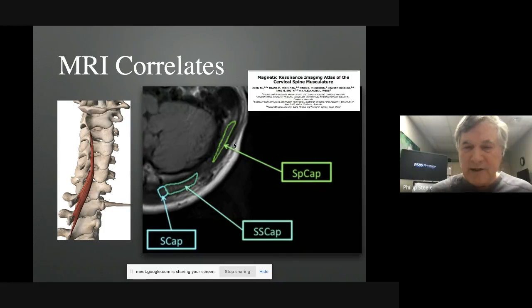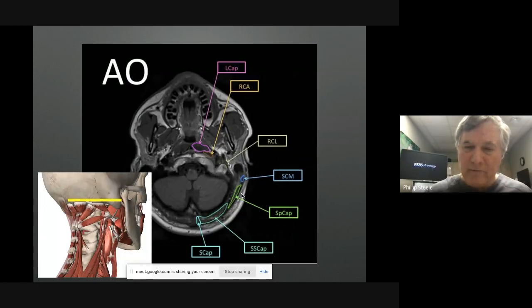That triangle area that I just showed you of the C1 was really difficult for me to figure out. And so then one day I'm scanning for any help. If you Google or use whatever search engine you want, MRI sliced image through that area, there's no literature out there. What's interesting is this one article is out there, and it shows all the muscle attachments they've highlighted. And it's an amazing piece for your library. I would encourage everyone to pull this article, screenshot this, and pull this article for your own library, because it's invaluable in terms of identifying all of these specific muscles.